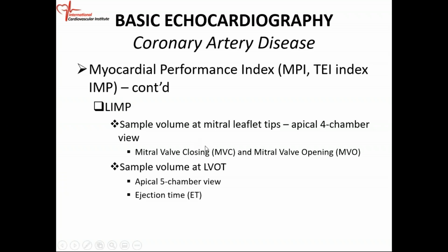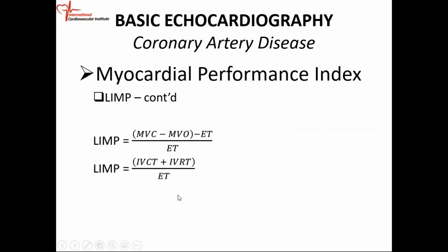Again, we're going to look at the mitral inflow. Remember, when you look at your Doppler, you can see clearly your mitral inflow, or where the mitral valve opens and where the mitral valve closes. So we will review that so you can visualize it. And then we also look at the LVOT in the five-chamber view and look at the ejection time, because the definition involves that. So this is the definition.